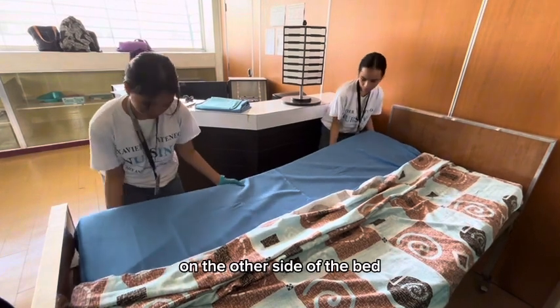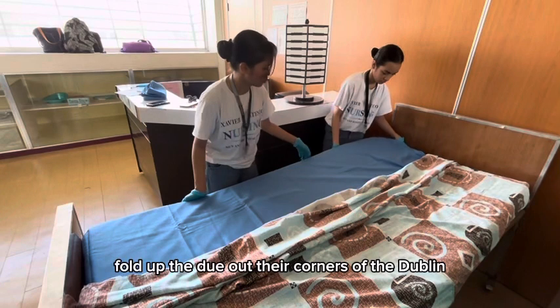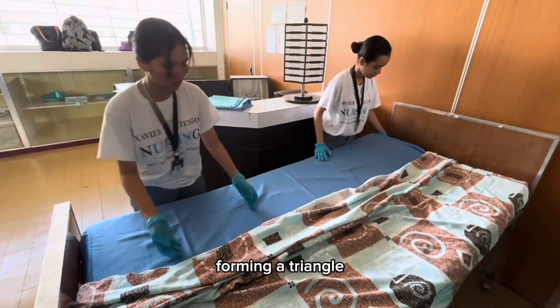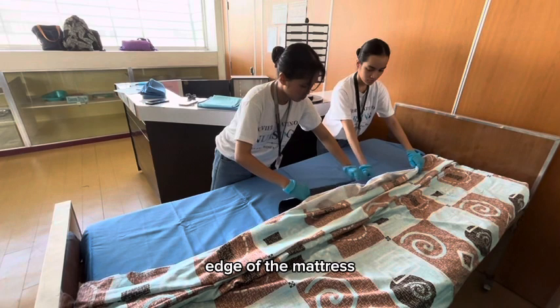On the other side of the bed where the client will be transferred, fold up the two outer corners of the top linens so they meet in the middle of the bed, forming a triangle, or you may fan fold in line with the edge of the mattress.